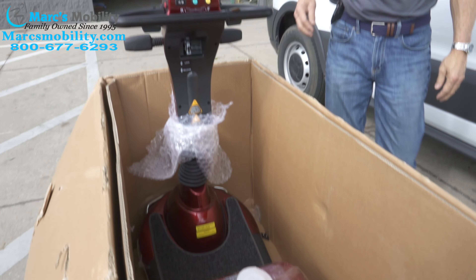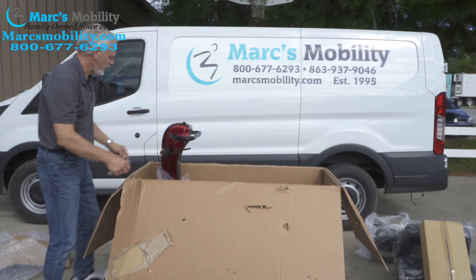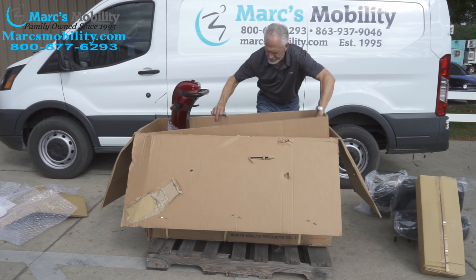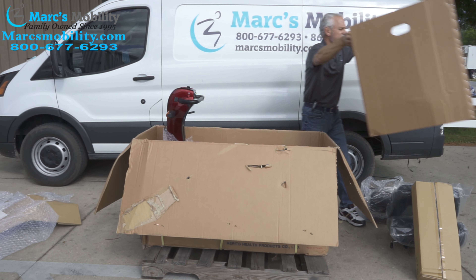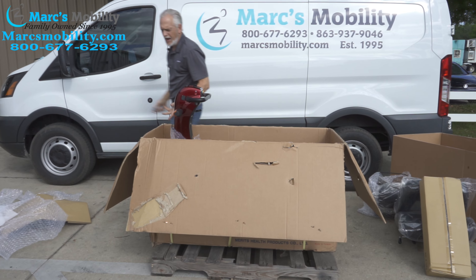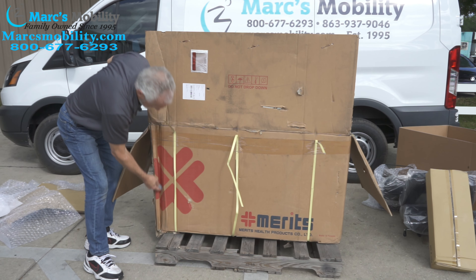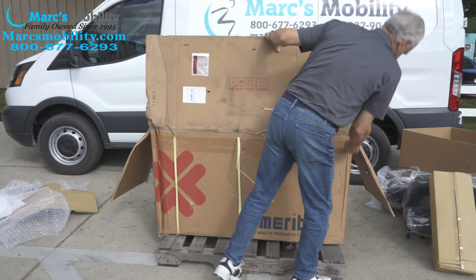Now, how do you get the scooter out of the box? The best way is — there's a liner in here you can pull right out. What I usually do is cut the box right here and right here. I'll also cut this side. If you have a good box cutter, be careful — don't cut yourself, these are dangerous.